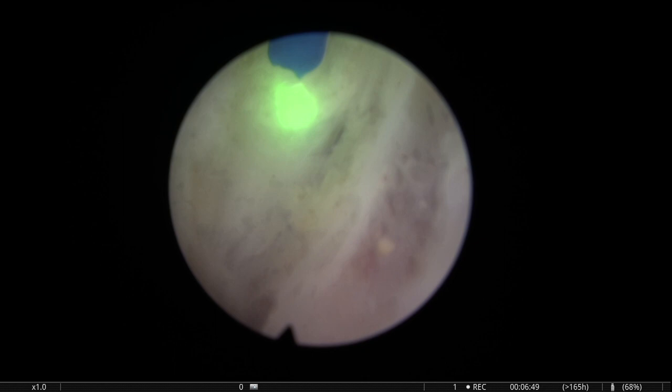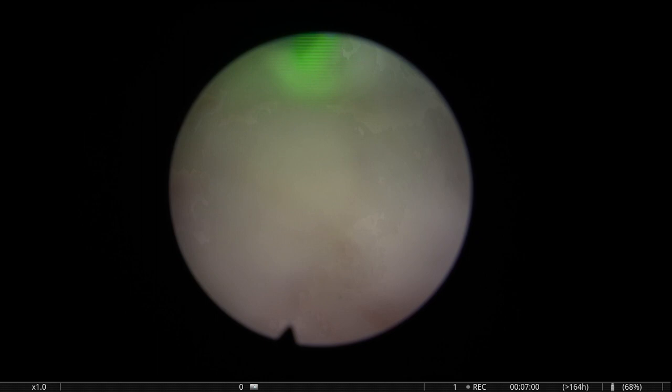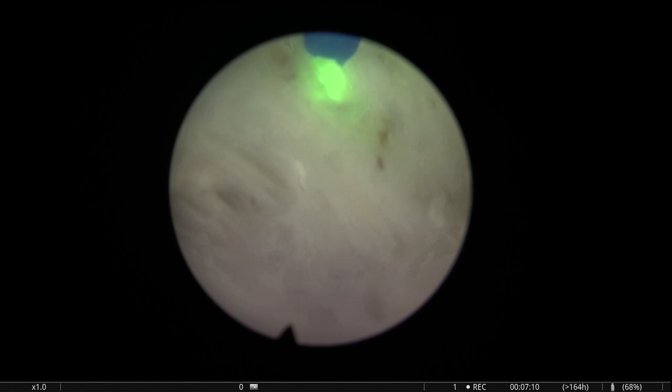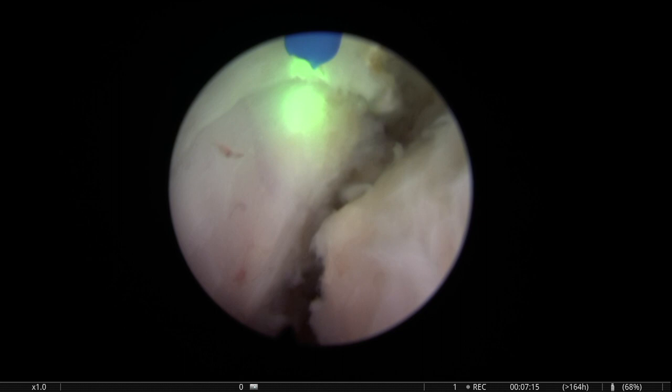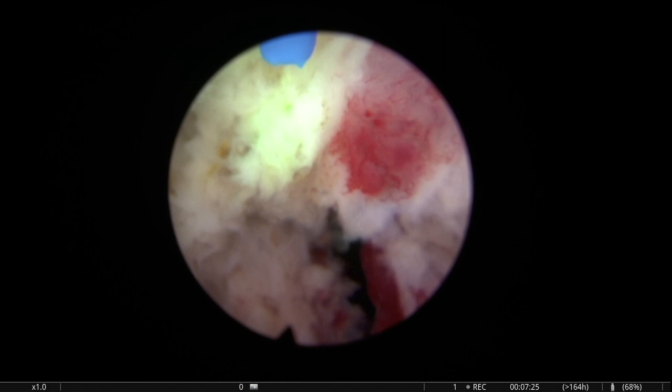So, here we are trying to do the apical liberation, early apical liberation. Typically, initially we do a little bit of dissection of the lower plane. Then we try to climb, you see, on top of the adenoma with the scope. Because when you climb on top of the adenoma, the nose, let's say, of the adenoma descends, and then these 12 o'clock fibers are easier to cut. You see that we will find more tissue constantly challenging our plane and having us to correct the plane.